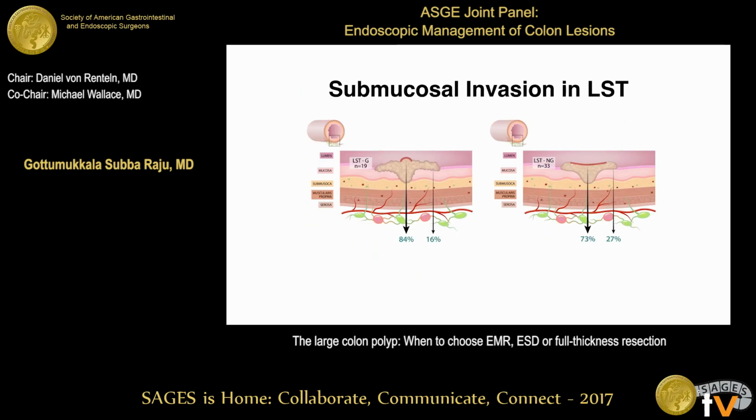In the last few years, we have been resecting a lot of large flat lesions that are defined as laterally spreading tumors, which can come as granular or non-granular type. Non-granular type have a much higher risk of involving the submucosa. And when it comes to the granular type, the risk of having submucosal involvement is higher under the sessile component of the tumor, especially if there is a mixed component, as you can see here.